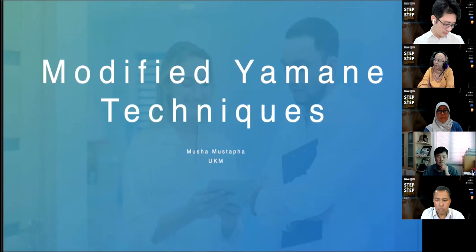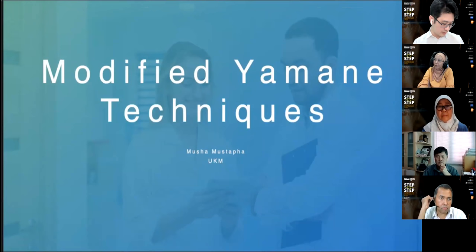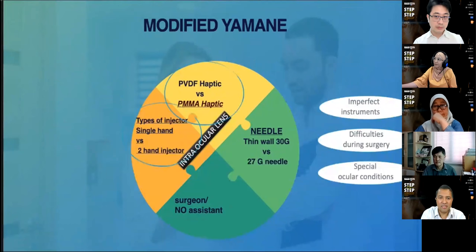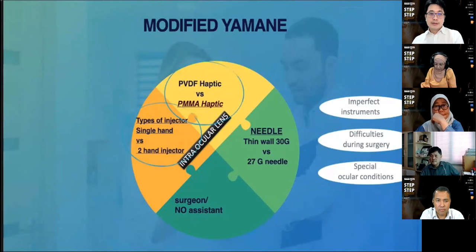We have seen how Dr. Chun demonstrated all the nice and perfect way of doing Yamane. So I'll be sharing the modified techniques when things are not perfect. The perfect Yamane technique requires a perfect combination of instruments with or without a good assistant. But if we are lacking in one of it, we can still do the surgery, of course, but with a bit of modification. So in other words, when do we need to use the modified technique?